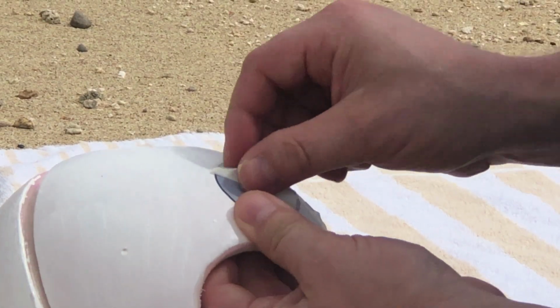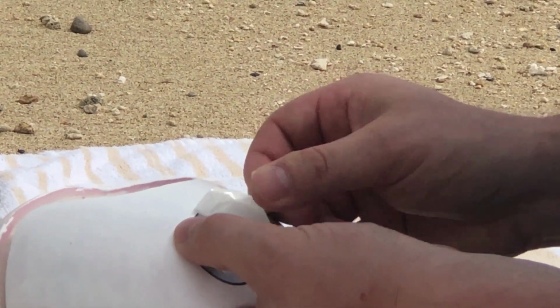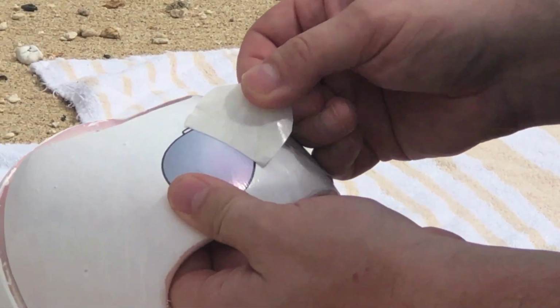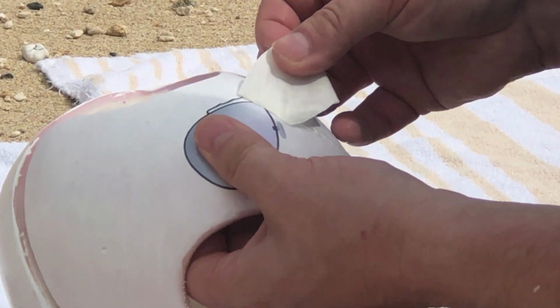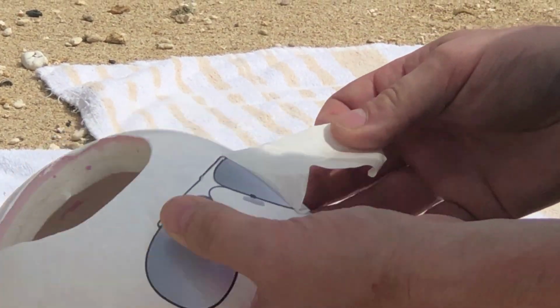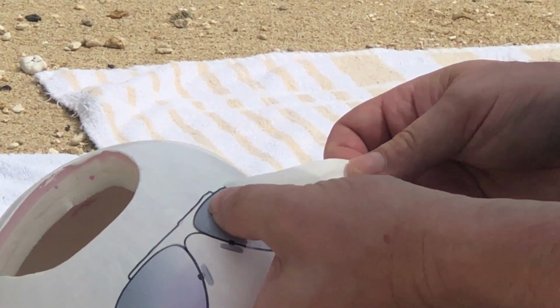Now that the glasses are down flat, I am peeling up the transfer tape to see the final result. This pair of glasses has a small metal wire across the front. In the final application of it, I pulled it up a bit and then stuck it down straight.